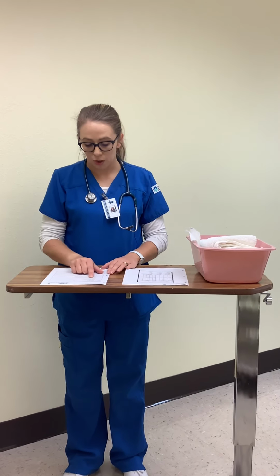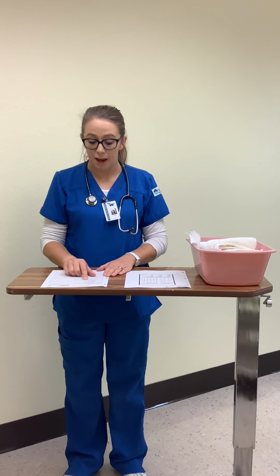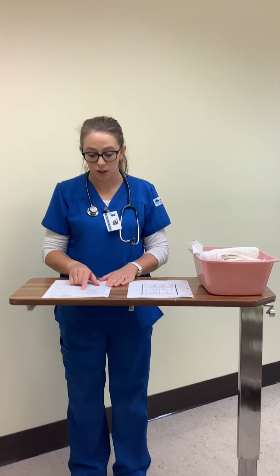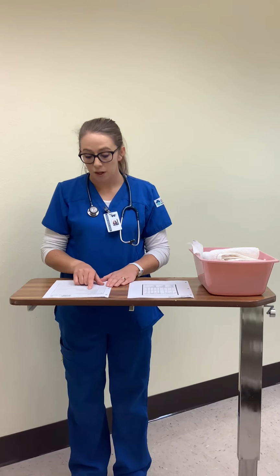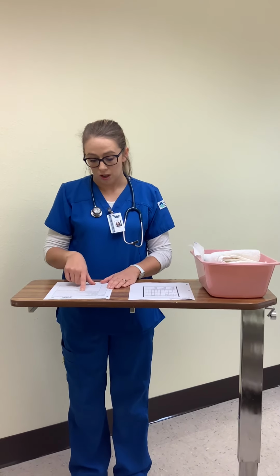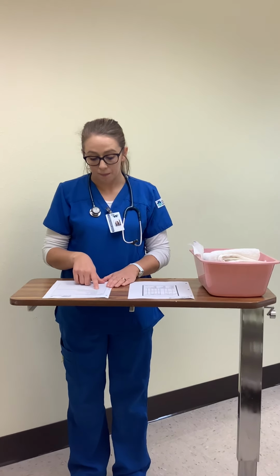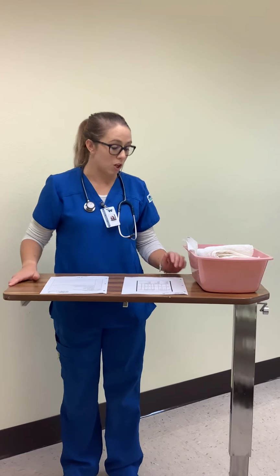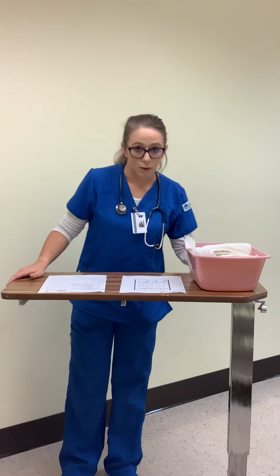Also, what the doctor has ordered is an ultrasound of the abdomen at bedside, an insertion of an NGT for gastric decompression, x-ray of the abdomen after the NGT insertion, and attaching that NGT to a low intermittent suction. So I'm going to knock on the patient's door and I'm going to enter.